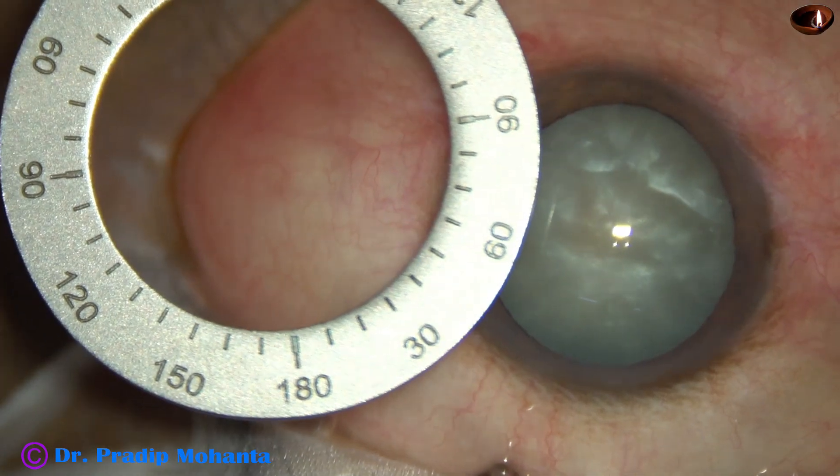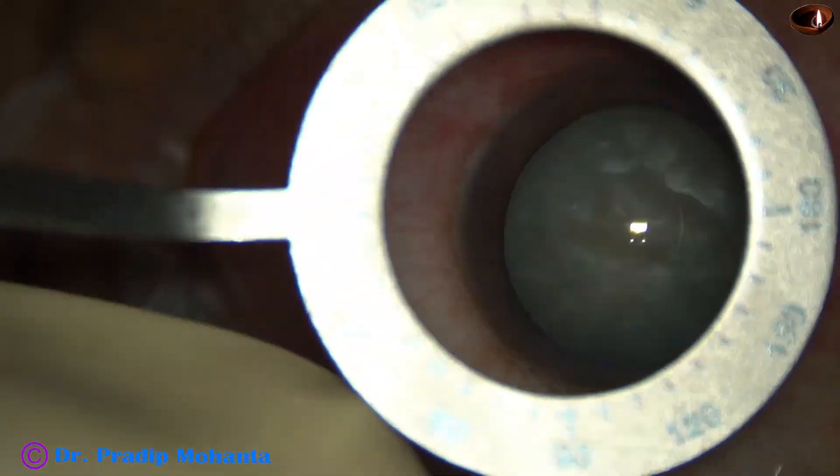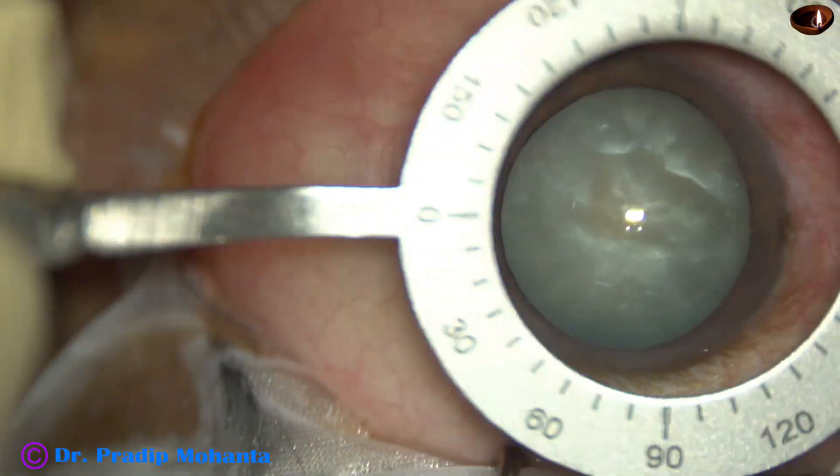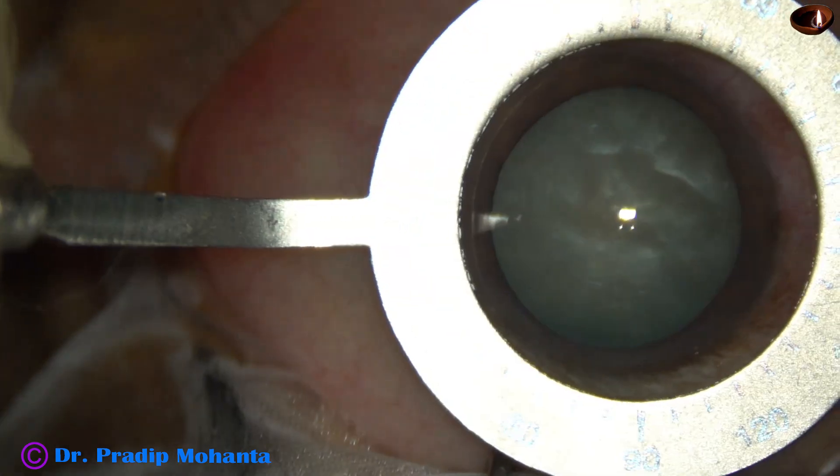Friends, welcome to MyWorkPlace at Ranak Heart in Bengal, India. In this video, I am going to demonstrate toric IOL implantation.